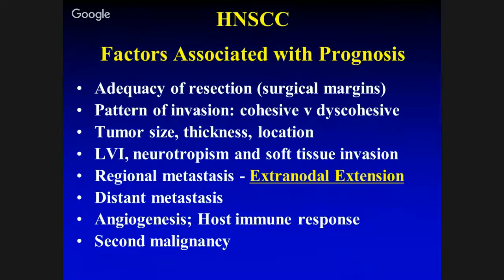But the next time you look at a resection, particularly oral cavity, and there's an invasive cancer, look there because you'll see often keratin granuloma. So that's the correlate. Often, it just doesn't happen on its own that there's keratin extruded in the absence of invasion.